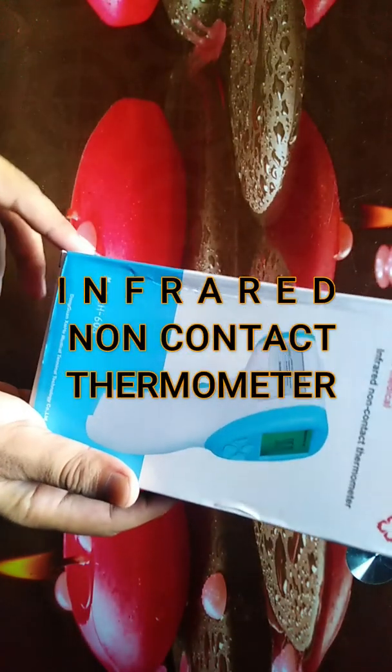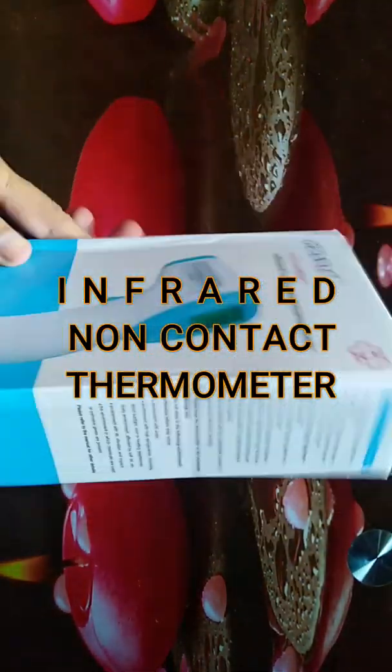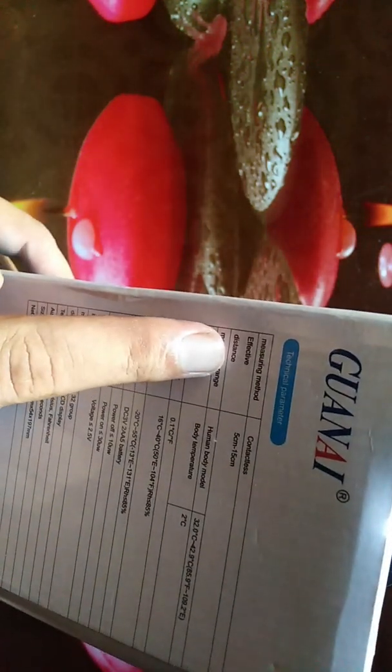Today I will show you how you can use the Entroid non-contact thermometer for medical purposes. Before unboxing, let's go over some technical specifications. The picture distance for measuring temperature is 5 centimeters to 15 centimeters. You don't need to make physical contact — it's a contactless thermometer and you can easily measure the temperature of a human body.